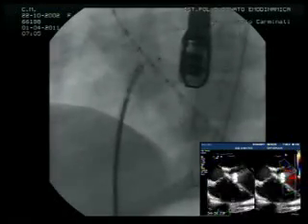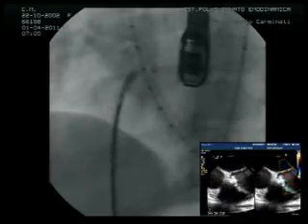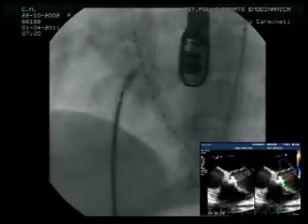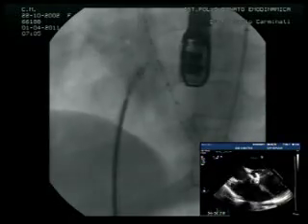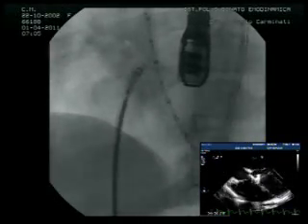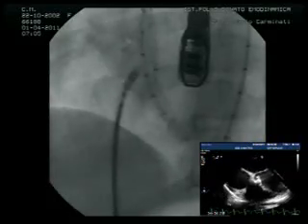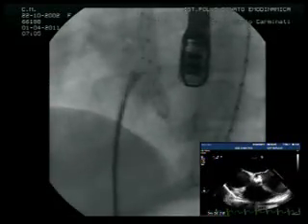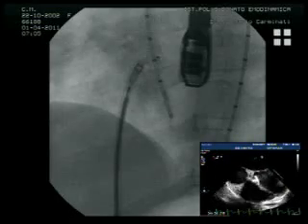So I think at this point I'm fairly well in the defect. Maybe we could do an angio, you think? I don't think we'll learn much. Why don't you do an angio just the same? Okay, we can come back a little closer then. A little closer, Kevin, to the defect. And you ready?